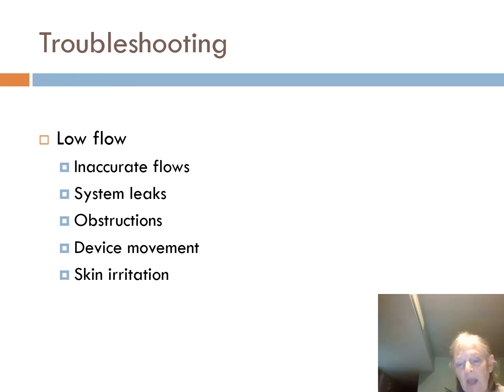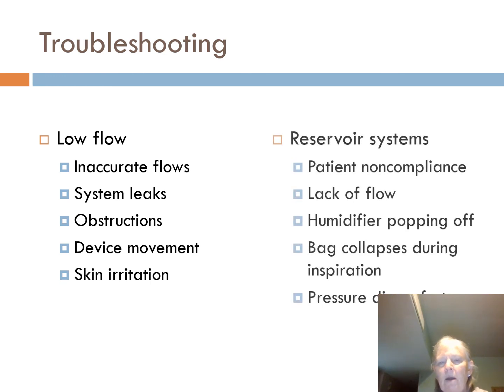You'll be okay. These devices, for the most part, especially with the nasal cannulas, do not stay put. They have a tendency to slide around. So sometimes in the morning when we would go see these patients, their nasal cannulas would actually be in their ears or they'd be in their eyes, and they'd tell us, oh, my eyesight's so much better. I don't feel too well, but my eyes are much better. And then skin irritation. Like I said, sometimes they pull on the ears and they do things like that that really bother folks.